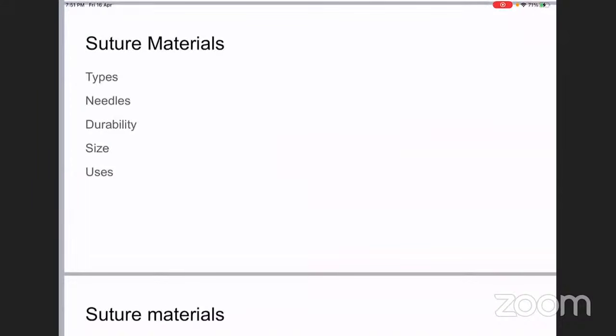That is a daughter concern of Johnson & Johnson. So it is a very specific brand name. So you're not lobbying any brand right now. So when they show you that purple absorbable braided polyfilament suture material, what do you call it? Polyglactin. Very good. So again, that is a synthetic suture material.